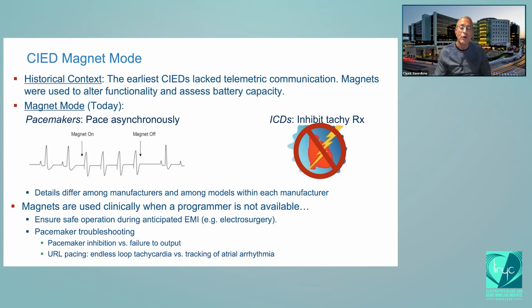If you don't have a programmer available in emergency rooms. And since this is not a pacemaker lecture, we won't go into that.